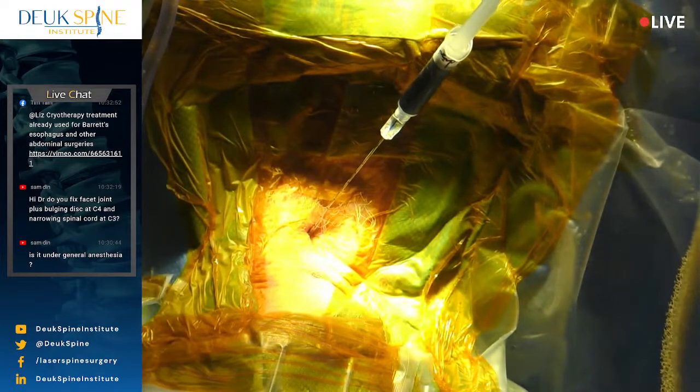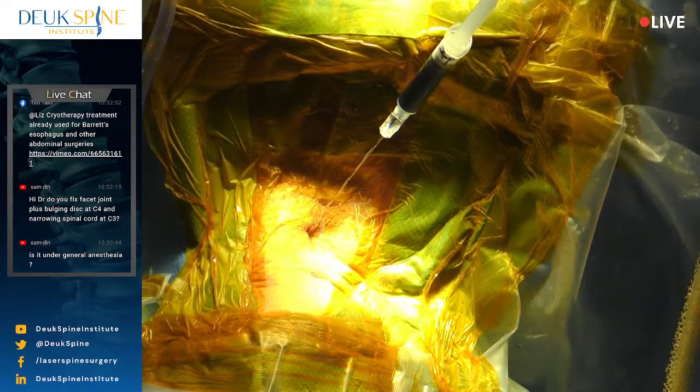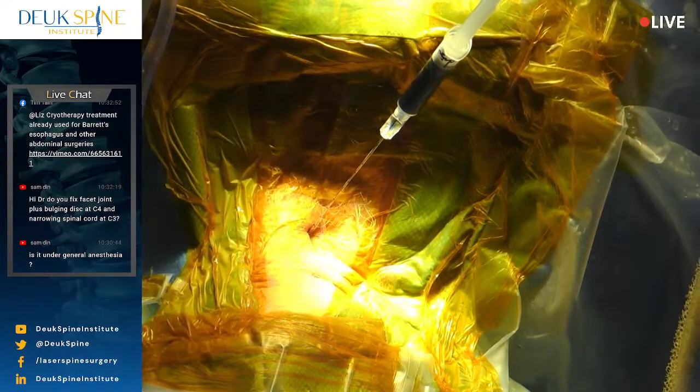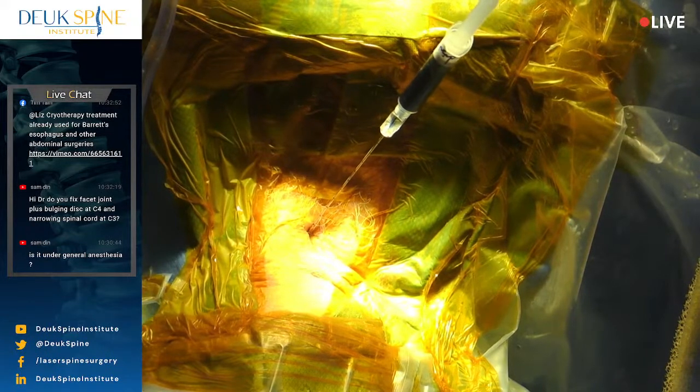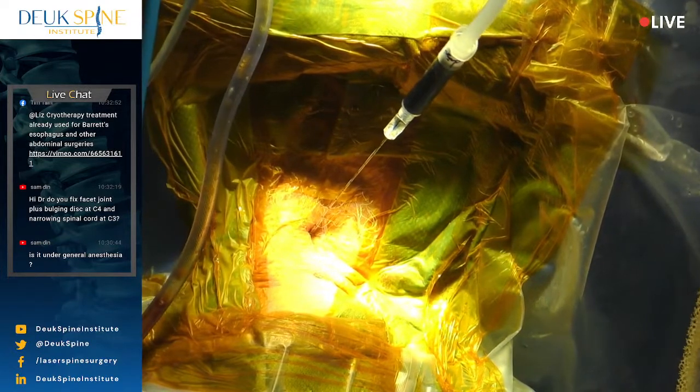And you also want to, while I'm in the endoscopic view, be able to see the herniated disc material, which is the nucleus pulposus, the center of the disc. That's what's herniating through the tear. Normal nuclear material is white. It doesn't stain blue. But nuclear material that is scarred will stay white too, but also with a blue tint.